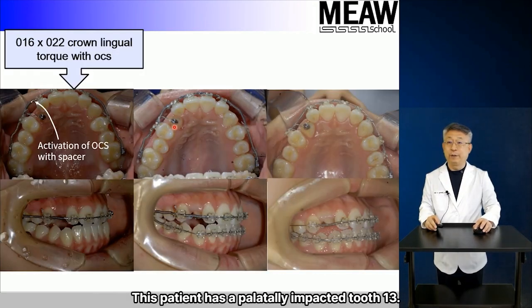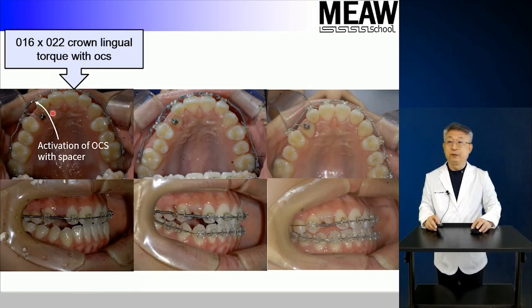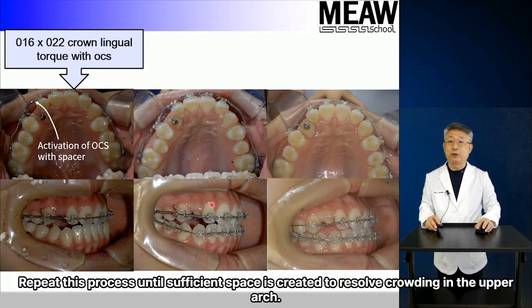This patient has a palatally impacted tooth 13. Space is created in the upper arch by using open coil spring on 016 x 022 SS wire with anterior crown lingual torque. On the next visit, open coil spring is activated by inserting a spacer or sliding hook. Repeat this process until sufficient space is created to resolve crowding in the upper arch.